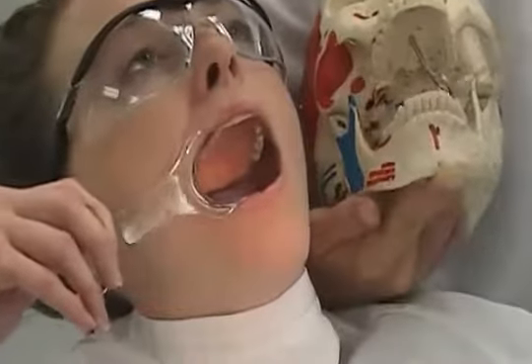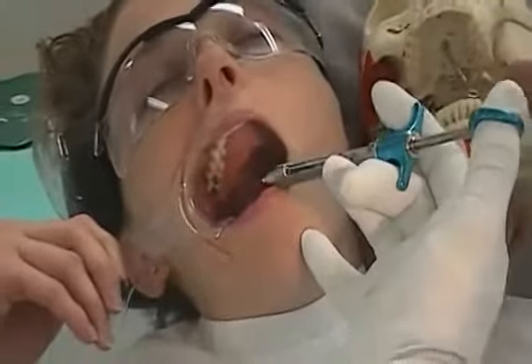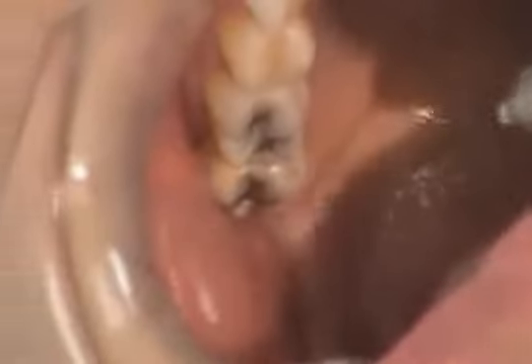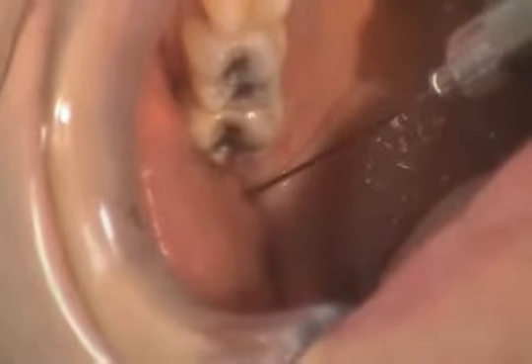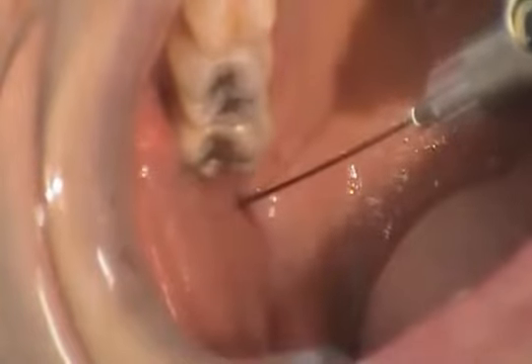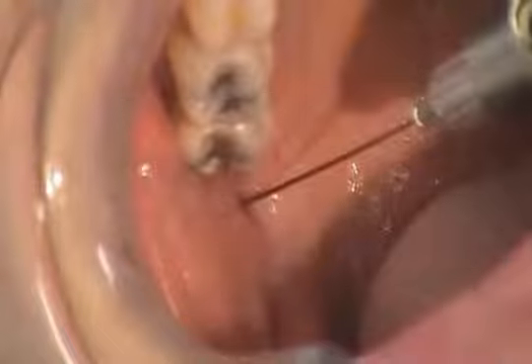Intraoral landmarks are the height of injection, established by placement of the needle tip just below the mesiolingual cusp of the maxillary second molar, and penetration of soft tissues just distal to the maxillary second molar at the height established in the preceding step. The orientation of the bevel is not critical. As normal, you would prepare your tissues at the site of penetration by drying with gauze and applying topical anesthetic.